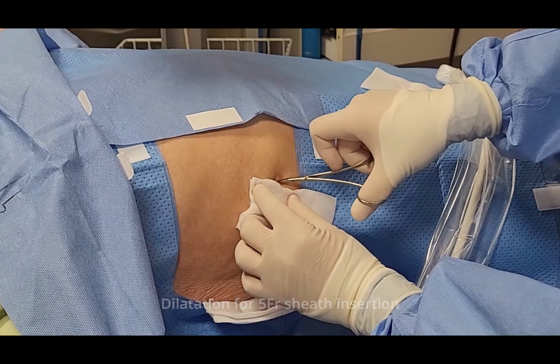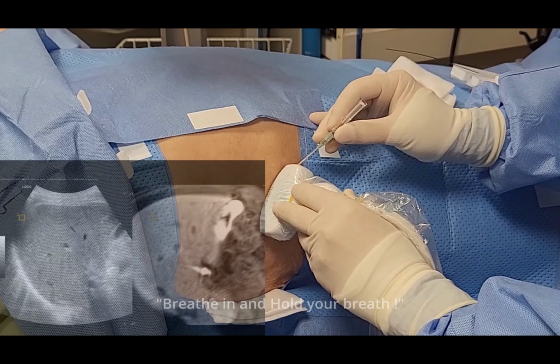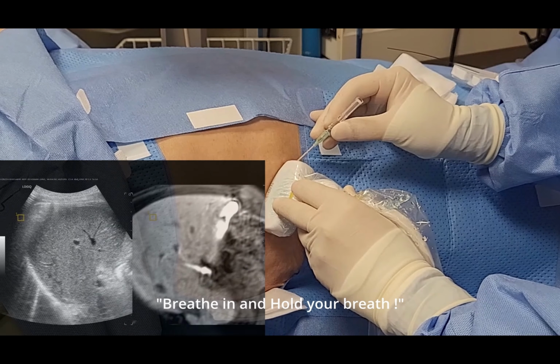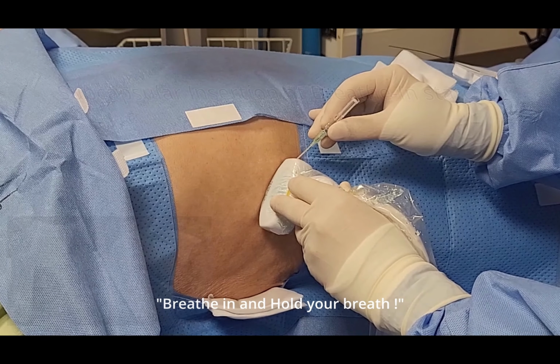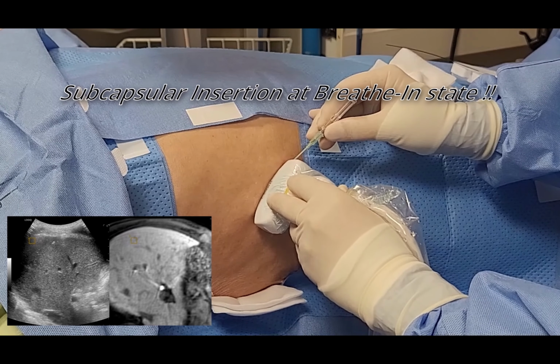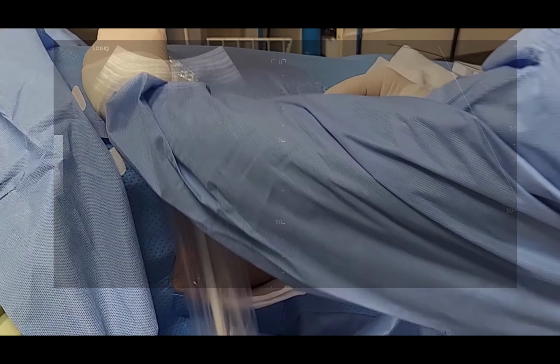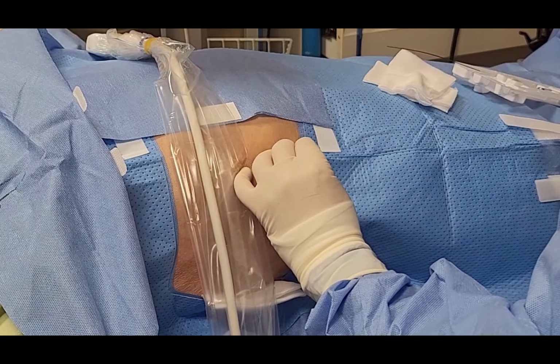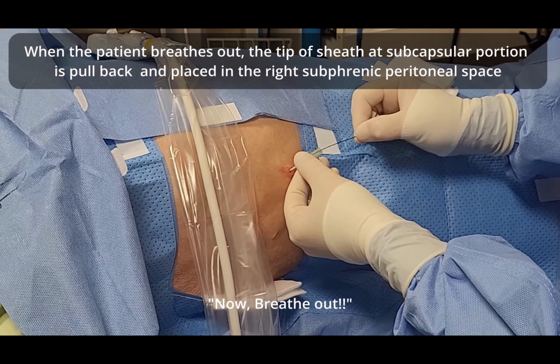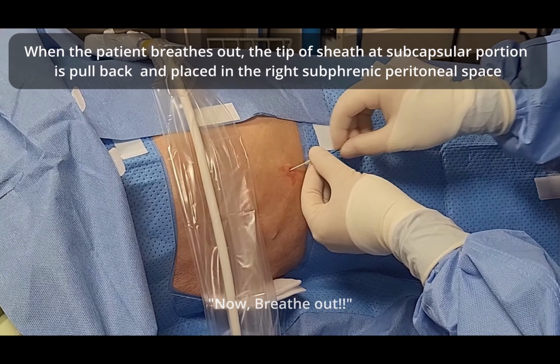Dilate for 5 French sheath insertion, like angiography. I insert the sheath needle towards the peritoneum, and then I instruct the patient to inspire a little bit. At this time, the liver is displaced downward. At that point, I insert the sheath needle 1 centimeter into the liver capsule. After I instruct the patient to fully expire, usually the tip of the sheath is placed in the peritoneal space.